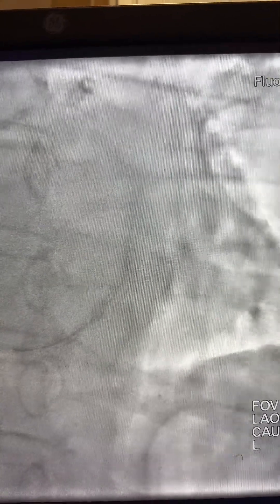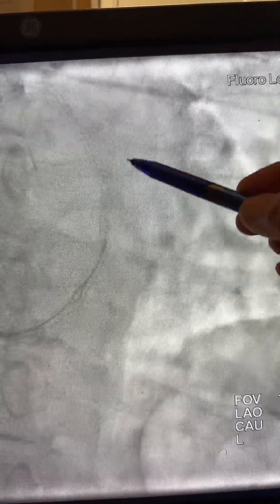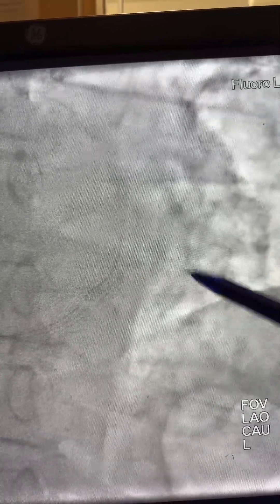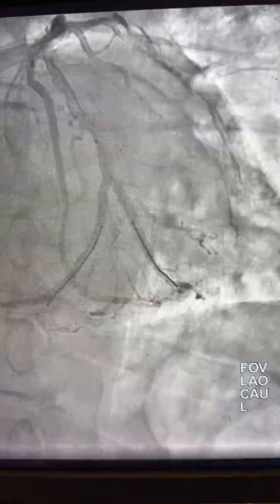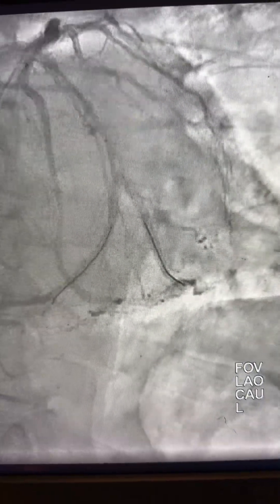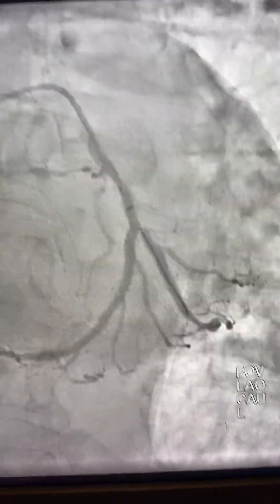We pulled it out of the main OM, advanced it with the balloon, and made sure the balloon is going through — not stuck on one of the struts. Since it's going through now, we pulled the balloon and wire and redirected the wire toward the OM again. We changed the strut position and made sure it's not behind the struts of the prior stent in the OM. Here is the angiogram before advancing. Even with the guide liner, this balloon doesn't want to go to the OM.